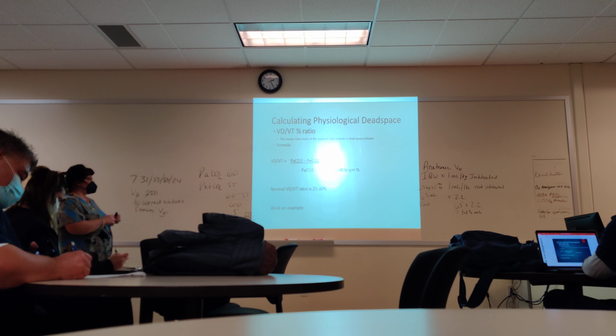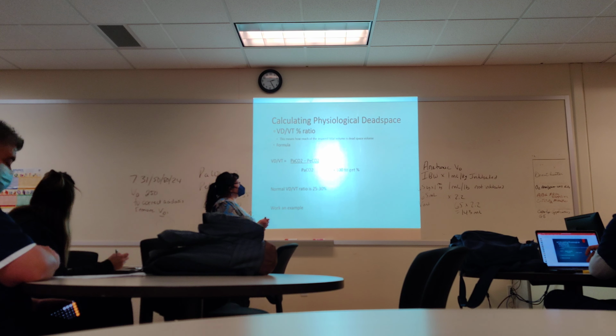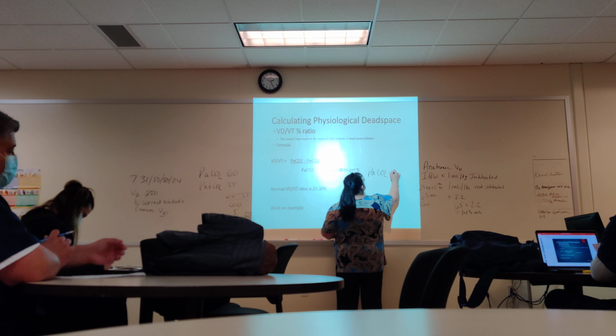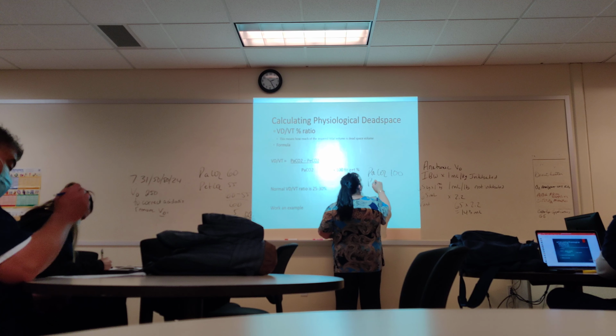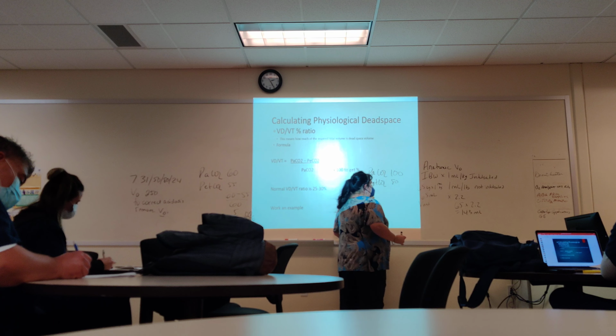So that's not so bad, right? But let's try it again. Let's say our PaCO2 on our blood gas is 100. And our end tidal reading something crazy like 80. What do you get?